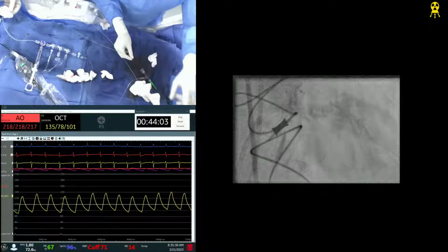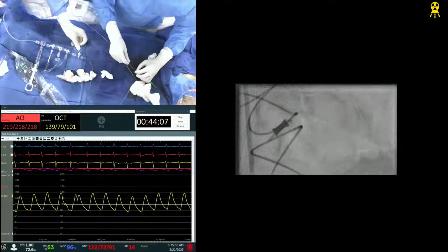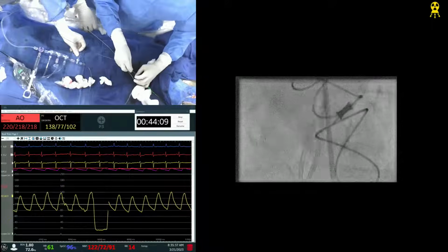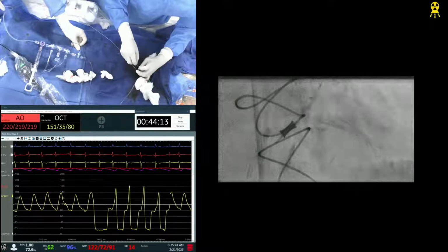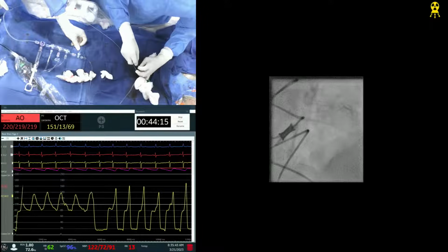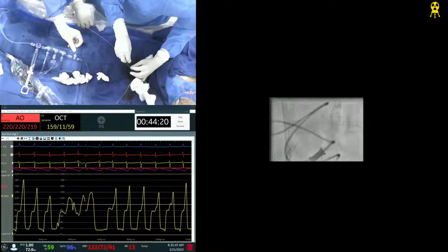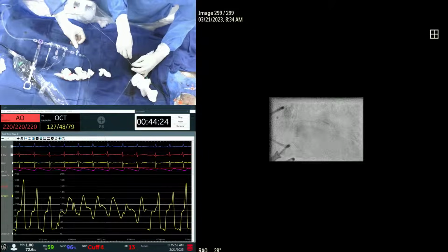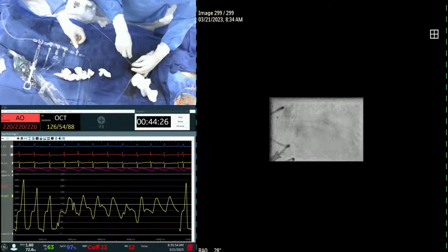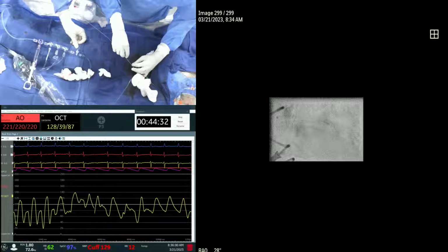You will not see it when you have the sternal wires. It has to be totally zoomed in to the stent only, towards the 1 and 2 o'clock position, rather than even 12. Right. Here. Okay. Now do a zoom, stent boost. No, just try one. Done? Stent boost, man. It's on the OCT.